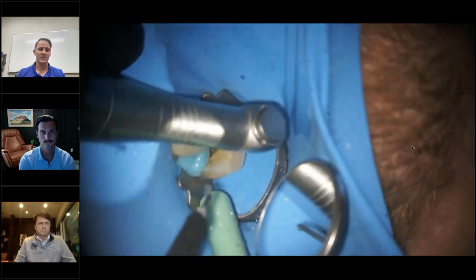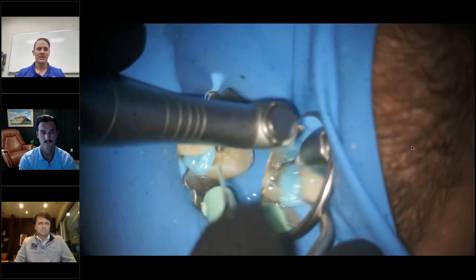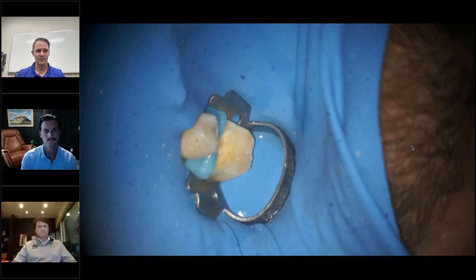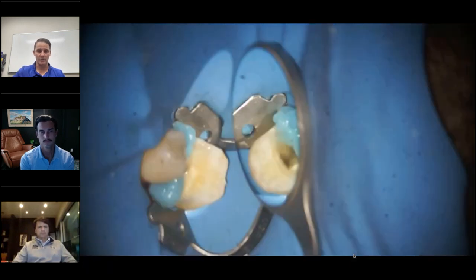What I want to do is spend less time. I want to get my shapes cut inside the tooth, and then allow the laser to do the disinfection phase and the cleaning and everything. So I'm not having to sit there and peck and wipe with the 2x2 gauze like we used to do. She just rinses off, clears the debris from the flutes, and then you can go in with your next one. So that's what I was showing there, just how efficient that is.